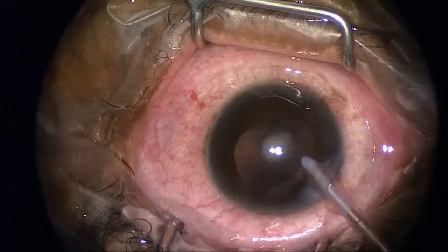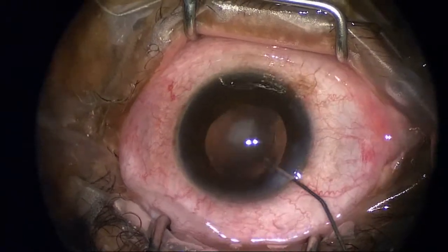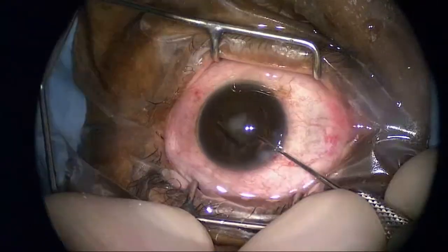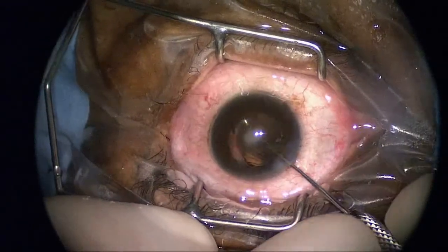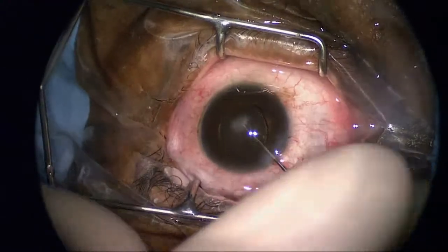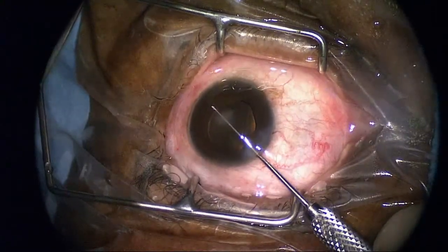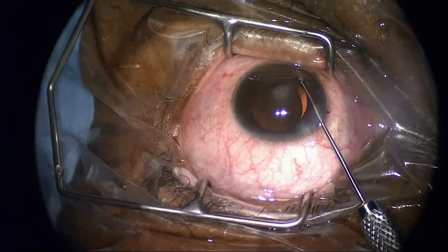Here I'm just removing the last part of the residual capsule and putting in some viscoelastic in preparation for insertion of the intraocular lens. This is a foldable acrylic lens. As much as I like the plate haptic lens, I tend not to use it in patients with DSEK procedures because if I need to replace it down the road and there's an open capsule, it can dislocate.